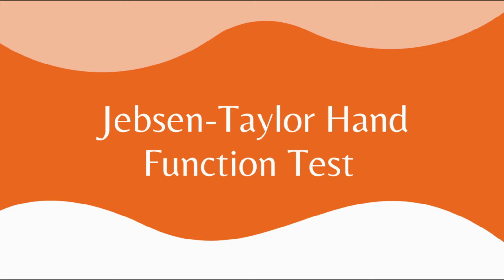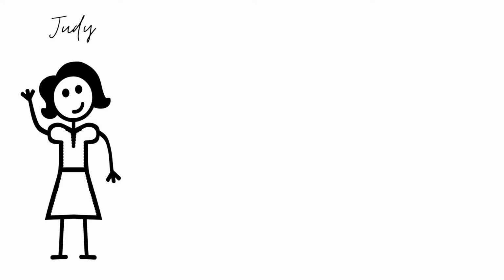This video will be going over the JHFT hand function test. Firstly, you will meet the client that this test is going to be performed on, and I will explain why this test is chosen for her. Next, equipment, environment, and consent will be discussed, followed by a demonstration of each subtest and how they are completed, scored, and documented. Lastly, I will go over the process of shared decision-making with the client.